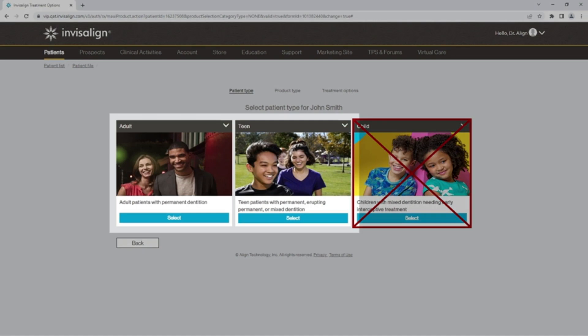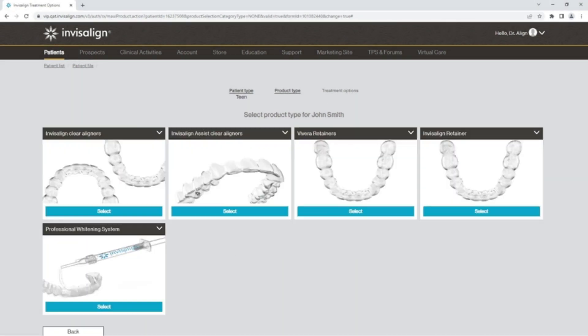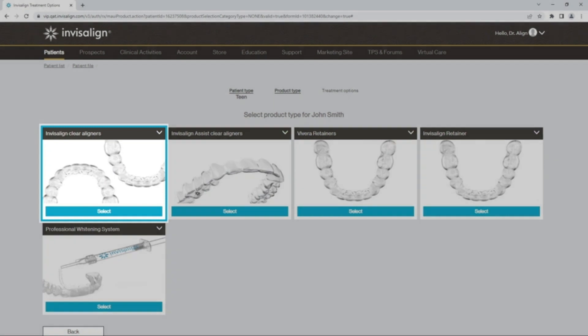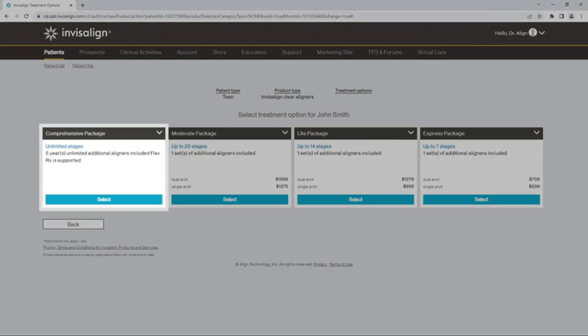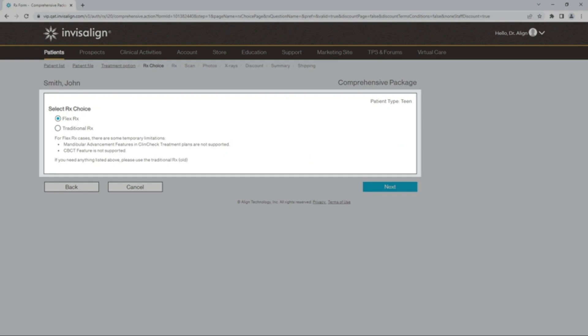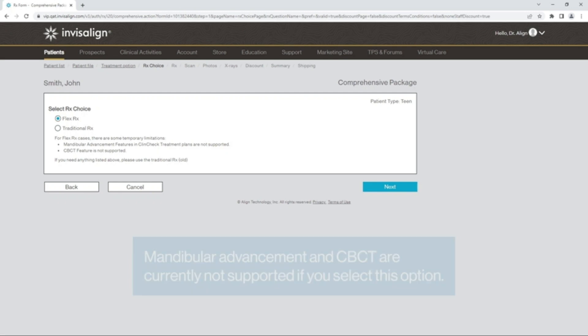Select Adult or Teen. Select Clear Aligners. Select Comprehensive Package. Select FlexRx for cases where a preference template is to be applied. Please note that Mandibular Advancement and CBCT are currently not supported if you select this option.